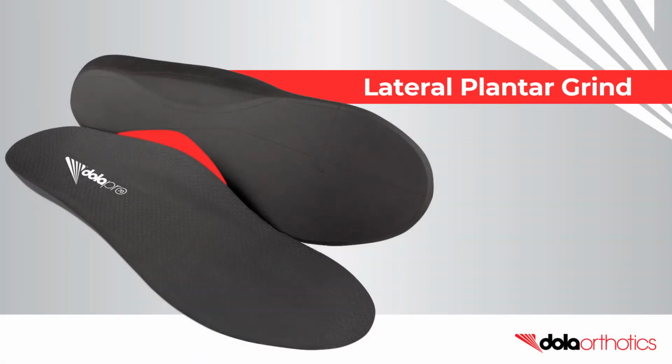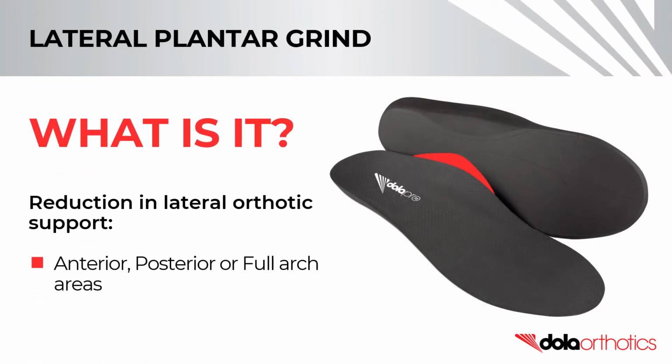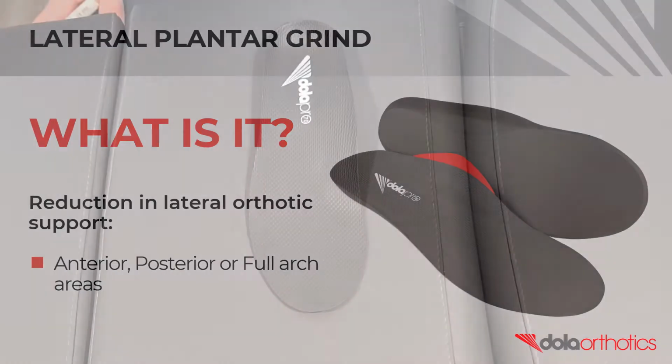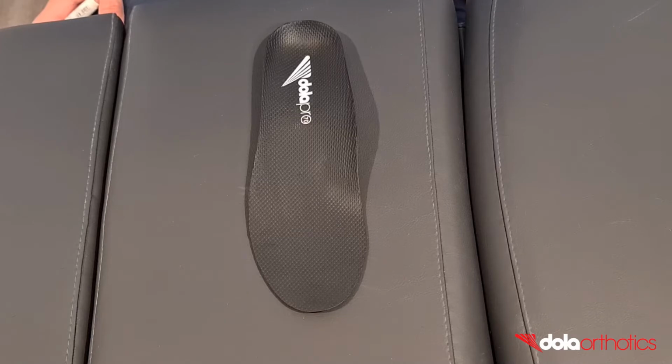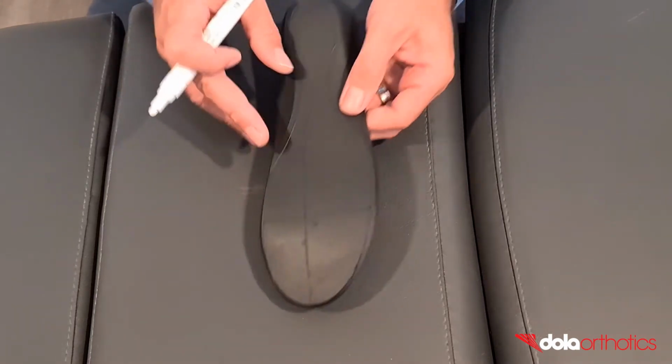How to customize your DOLA Pro with a lateral plantar grind. A lateral plantar grind is the reduction in lateral orthotic support and can be applied to the anterior, posterior, or full arch areas. In this video, we will show you how to complete a mild lateral plantar grind of the full arch in clinic. A plantar grind requires 4 landmarks connected by curves to indicate your grinding lines.